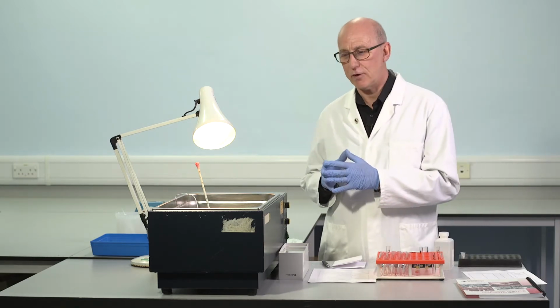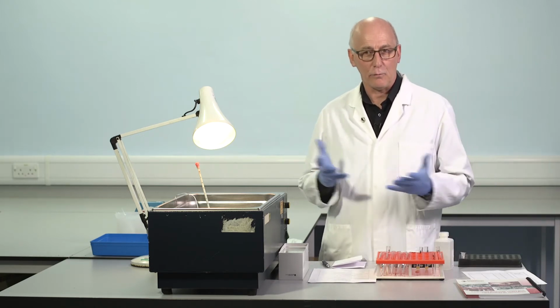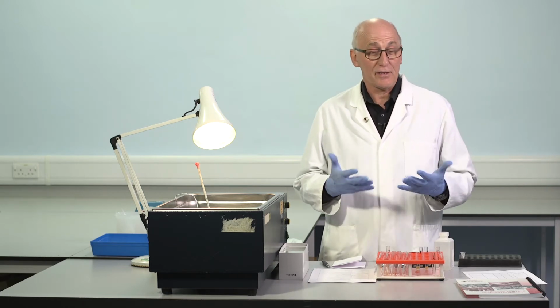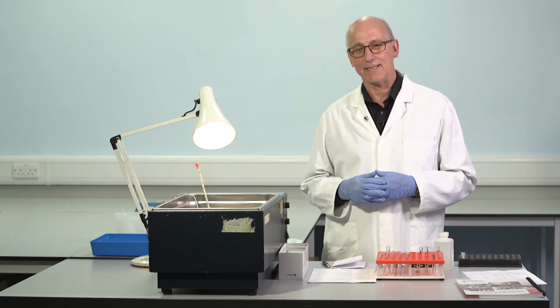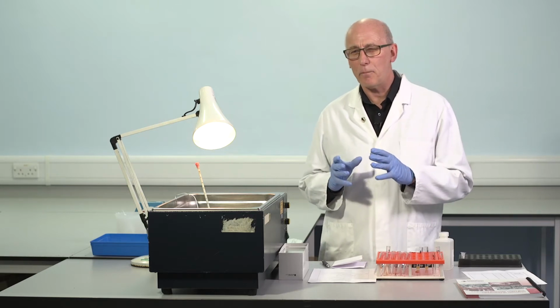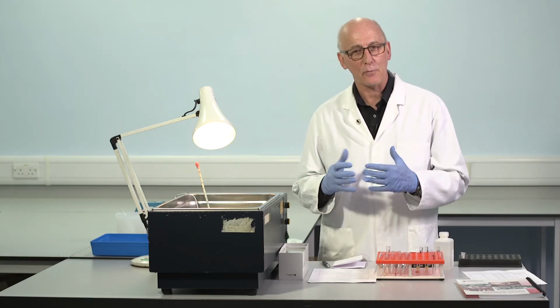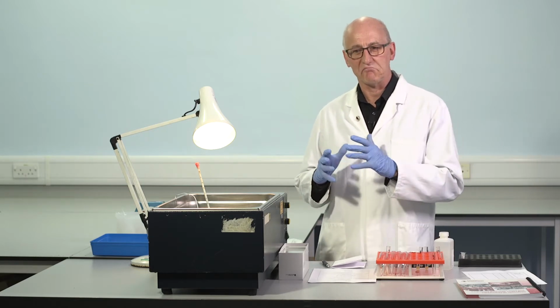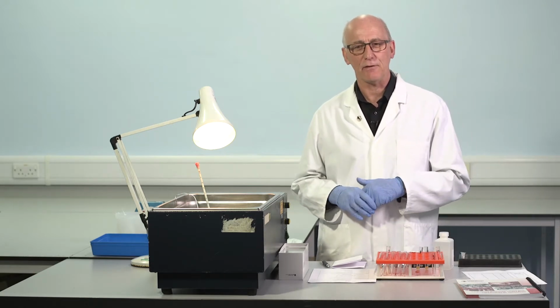We're going to be doing this demonstration using a manual method in the water bath, even though we recognise, of course, the majority of factor VIII assays worldwide increasingly are performed on highly complex autoanalyzers, semi-automatic, fully automated systems. But I think it's important to keep in mind the principles of the test, and that's much more easily visualised and discussed using manual technique. I think it helps people to understand the problems, the issues, the limitations, if we can actually remind ourselves which components are working in which way, and that's much easier in the manual method.